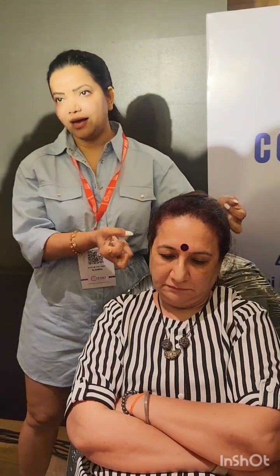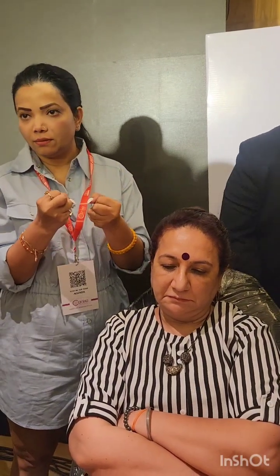Okay, so one correction more. Monofilament cannot volumize the skin, because that's floating type. It does not have the propensity to lift and correct anything. But yes, if you are introducing many threads, say 3 to 4 packets, like a mesh technique, then obviously it can give a little bit of strength and a little bit of lifting, but you cannot promise that to your patient. Because something which is hanging does not have the capacity to lift, right? You have left it hanging in the skin. So how will it lift?